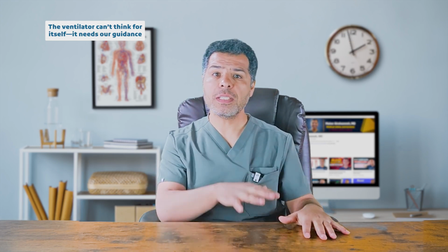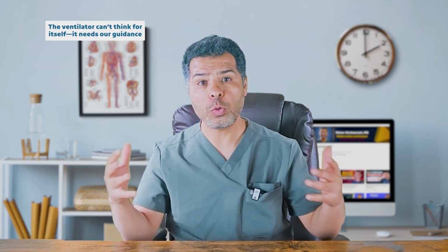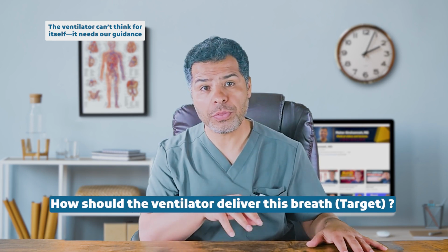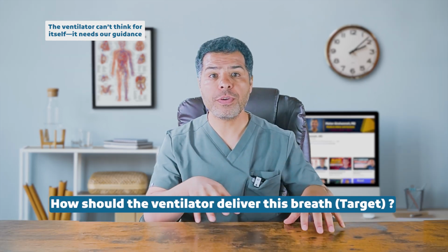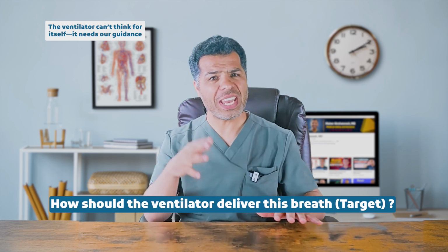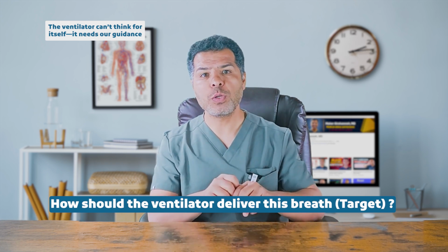Now, the ventilator is about to deliver a breath, whether an A, assist breath, or C, control breath. In which way should the ventilator deliver the breath now? In mechanical ventilation, we refer to the way of delivering the breath as the target. And although the term can be confusing, the concept is straightforward. Just give me your full attention here.